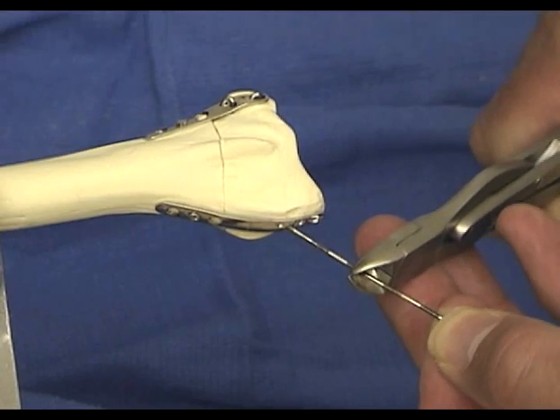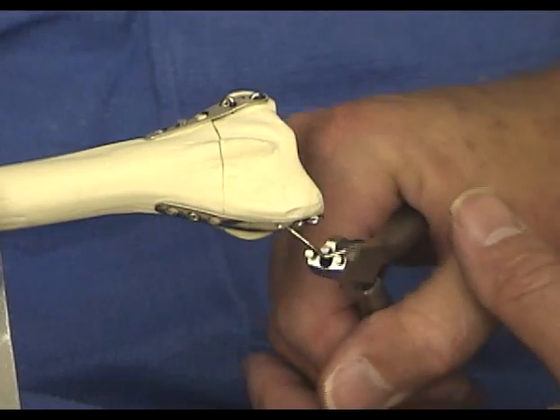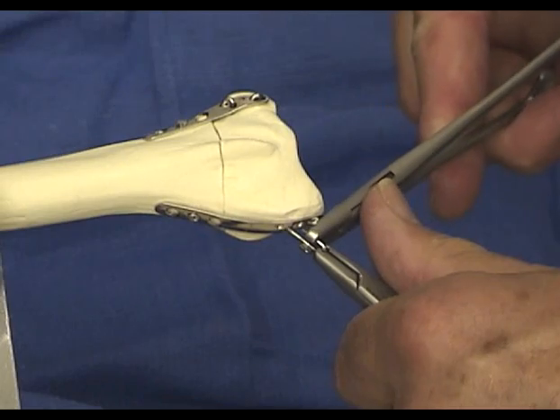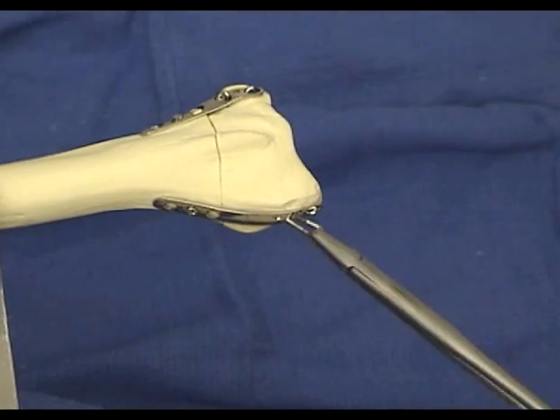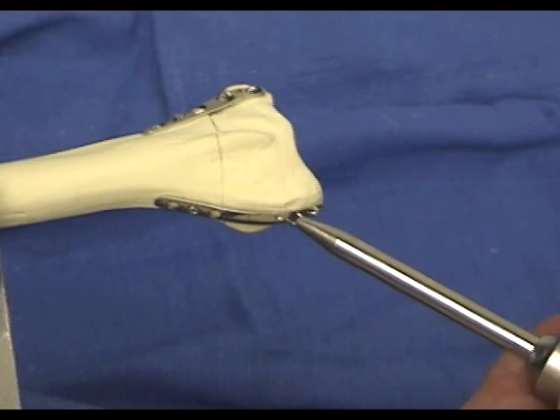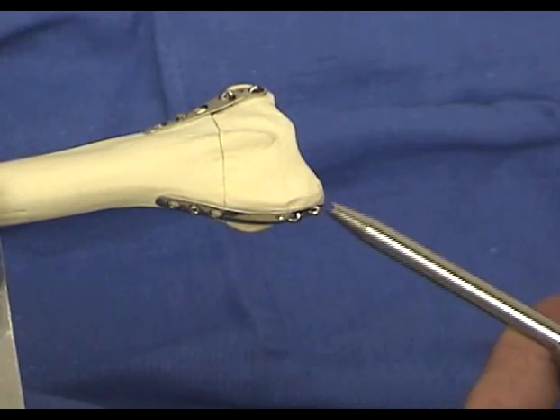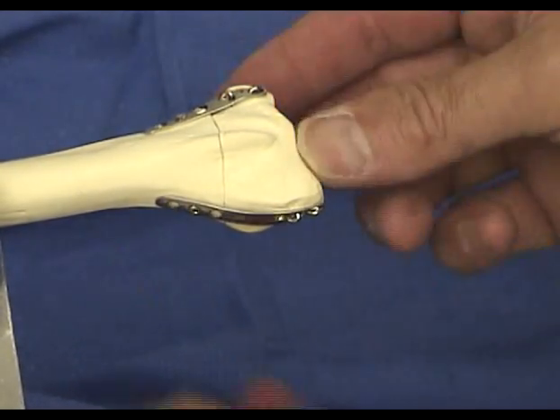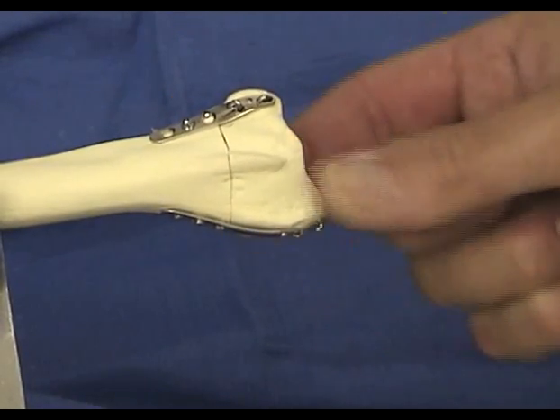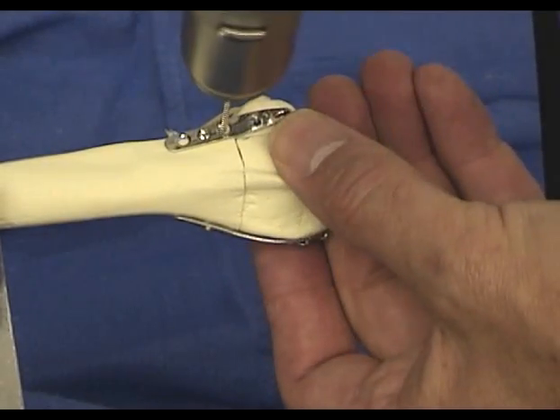Except for unusual circumstances, two pins should always be used in conjunction with the radial pin plate. The combination of the radial and ulnar pin plates provides excellent stability for fractures with a single radial column and ulnar corner fragment. As a final step, at least one additional screw is placed in both the radial and ulnar pin plates.